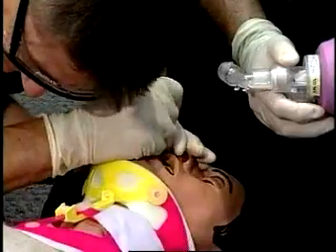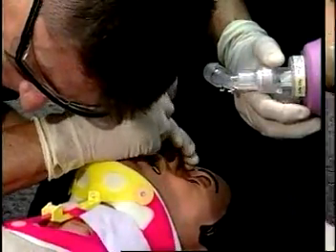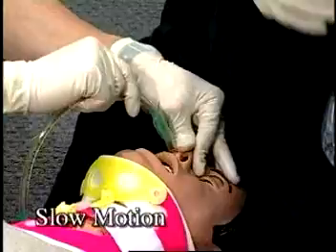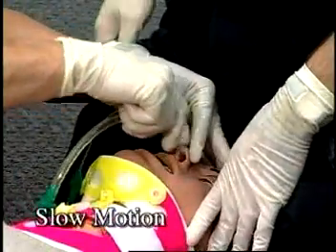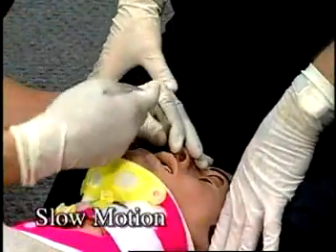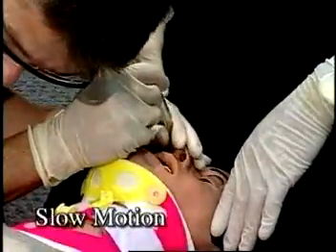Slightly rotate the tube back and forth while listening. Stop further rotation when breath sounds are the loudest and maximum misting of the tube is visualized as the patient exhales.